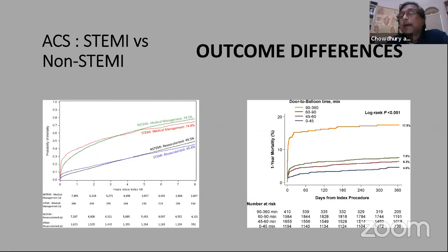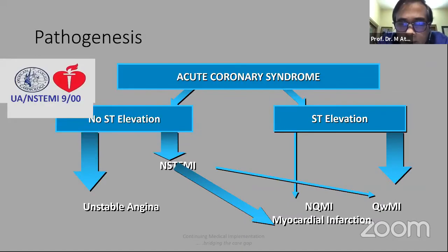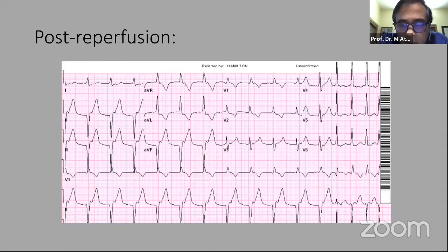Yeah, Athar Bhai. Sir, actually the ECG that is considered as the idioventricular rhythm, my question is that the rate is less than 100, QRS is not so wide, 1:1 conduction, retrograde P after the QRS. Can we draw a differential diagnosis from the examination point of view? Can the junctional rhythm be a differential diagnostic point, or is only the idioventricular rhythm the reperfusion arrhythmia, or what are the other arrhythmias that can be reperfusion arrhythmias? Two questions. Okay.